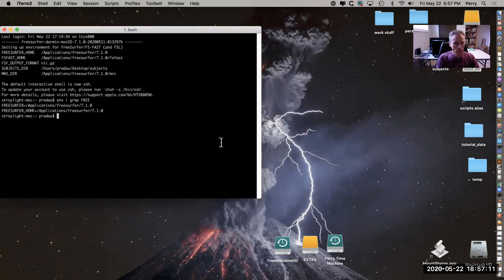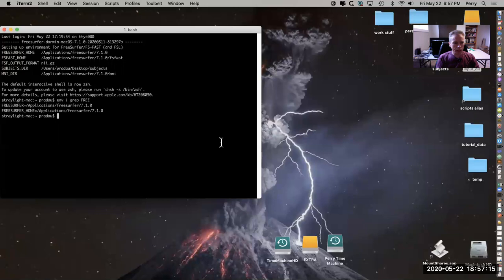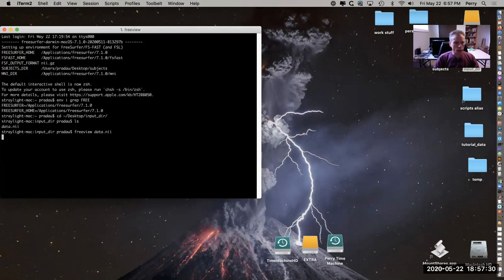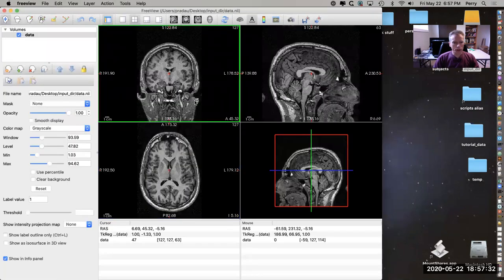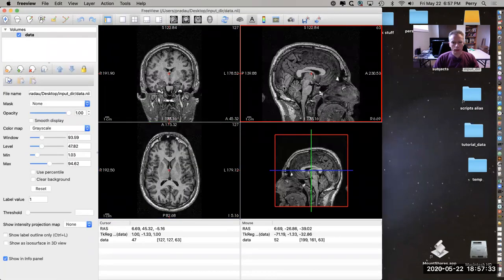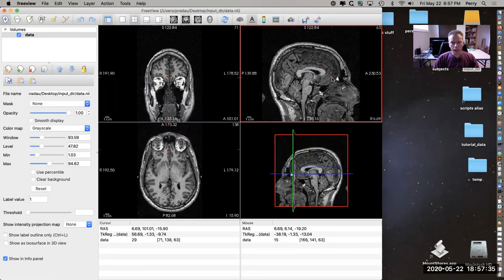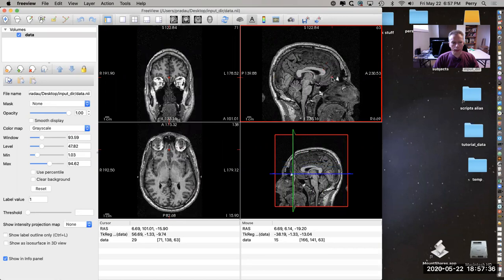Let's go to the directory where we have the data. I already created this directory and I put some data in it. You can see with FreeView that it's actually appropriate data - this is a nifty file and you can see this is T1 weighted MRI, that's what we want for FreeSurfer.